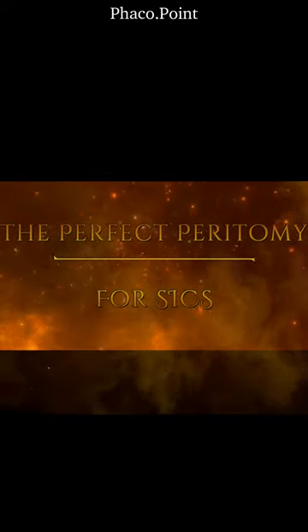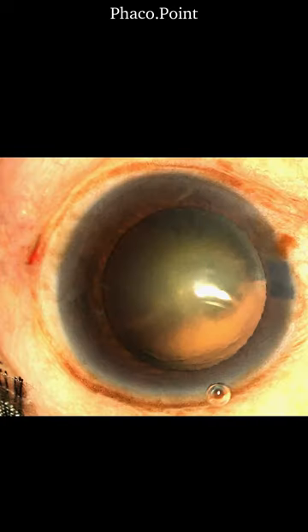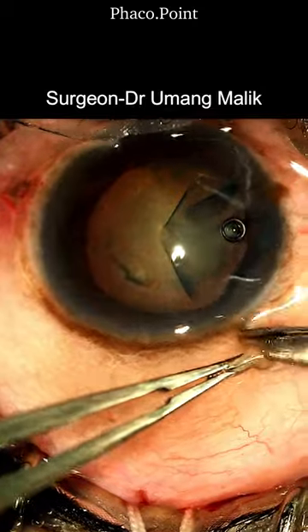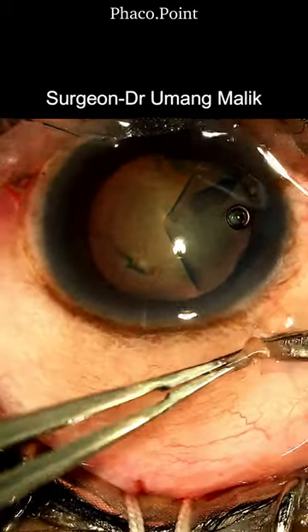Here's how you can perform the perfect peritomy for your SICS. The initial nick in the conjunctiva is made on the right side, just beyond the anticipated end of the tunnel.